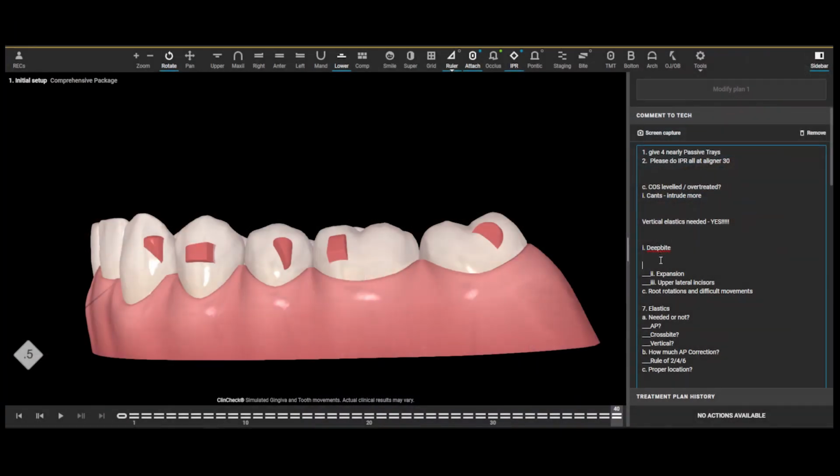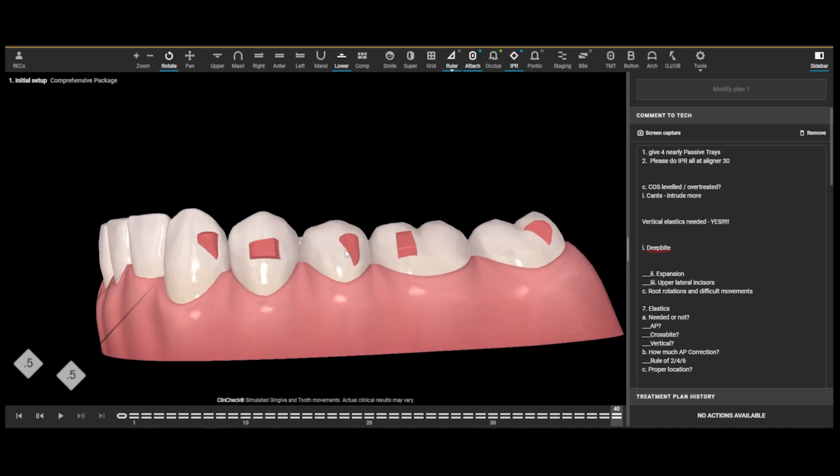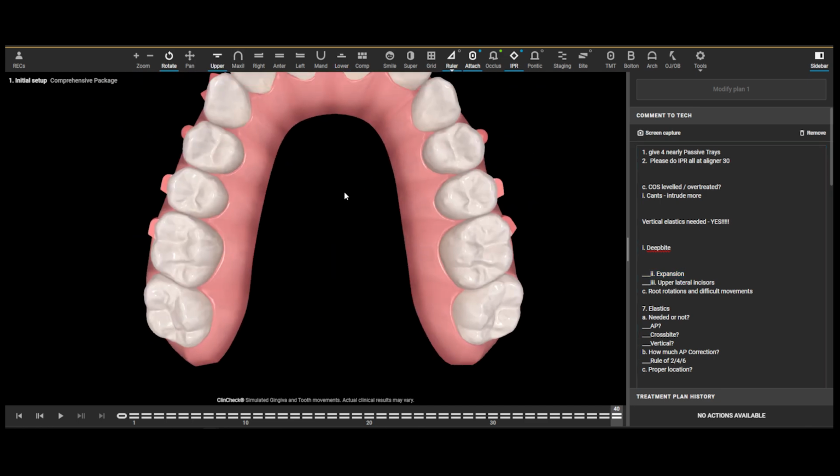I really wish that they allowed me to do that with this software on the online version because I want to now modify this to show you, but instead I'm gonna have to show you just on a kind of different plan. I'll show you how I do it in a moment here, but I wish I could do it differently. So yes, we do want some new attachments that we might use for the deep bite correction on the lower premolar.